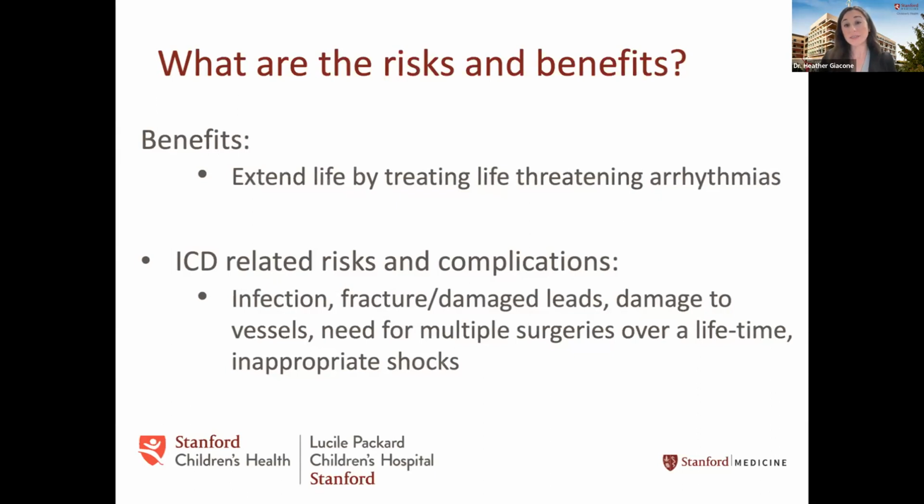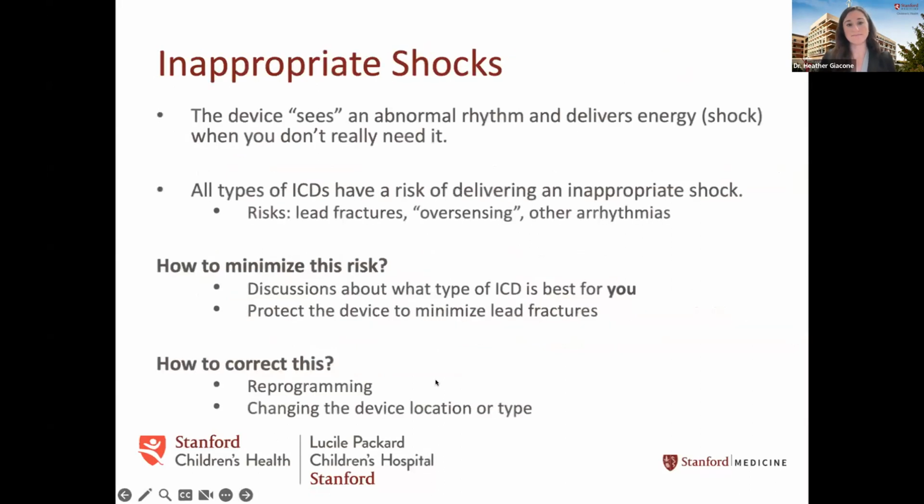If you have a transvenous device, you can have damage to those veins or vessels. And then, of course, as a pediatric cardiologist, I know that there will be multiple surgeries needed over a lifetime. So we take that into account when we're recommending one type of device for you. Now let's talk a little bit more about inappropriate shocks.